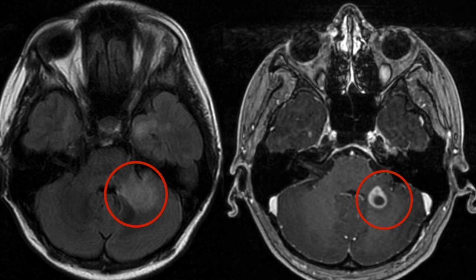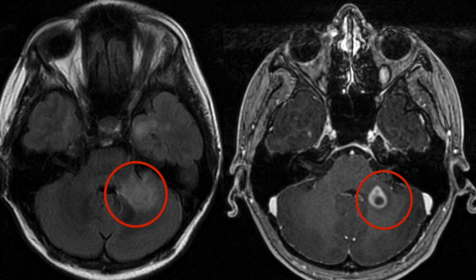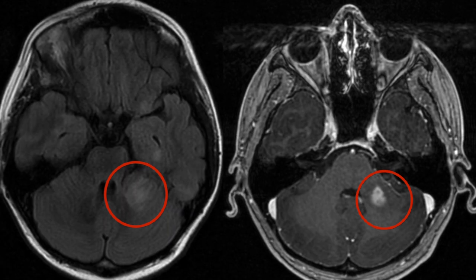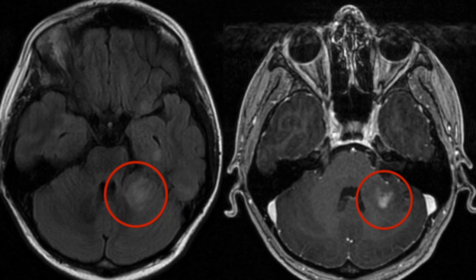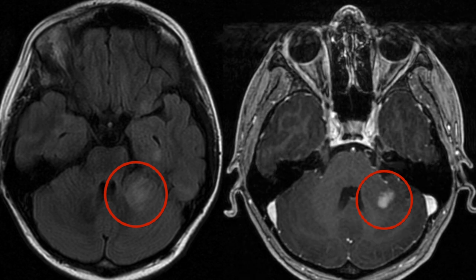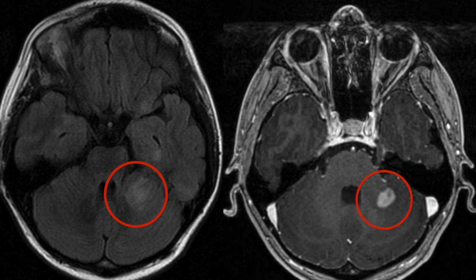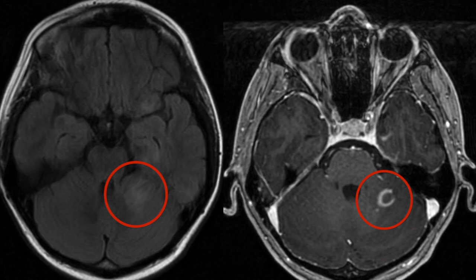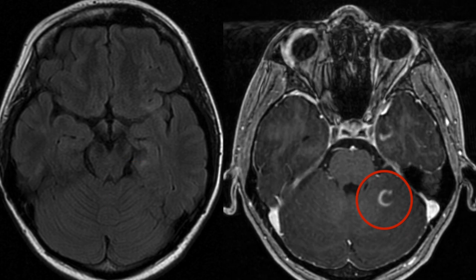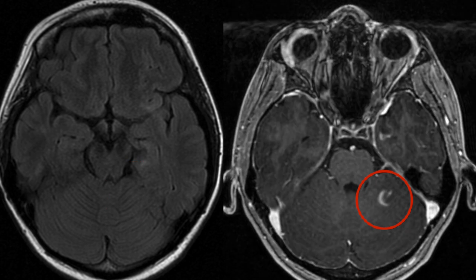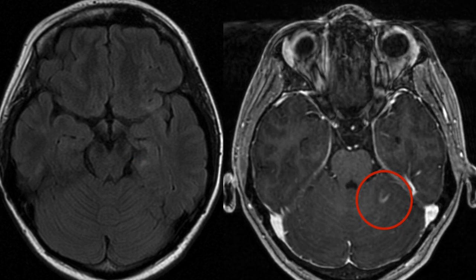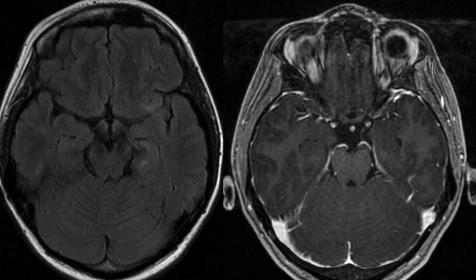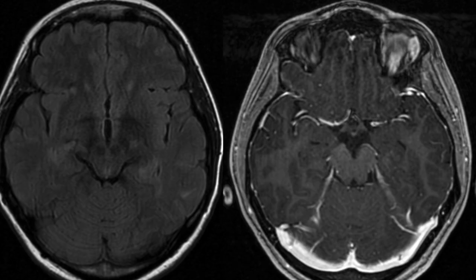On the right hand side, the post-contrast study, we see that there's abnormal contrast enhancement and more specifically there's ring enhancement. This tells us that this lesion is brand new, because the breach of the blood-brain barrier and the leaking out of the dye from the blood vessel into the brain only occurs for a few weeks when the lesion is brand new.